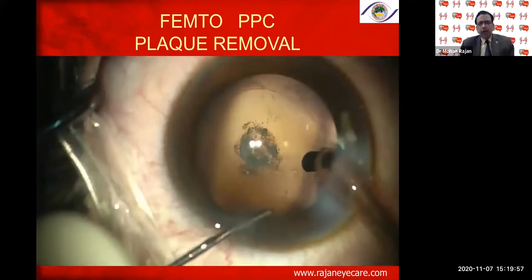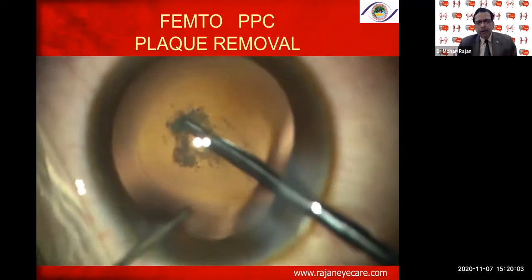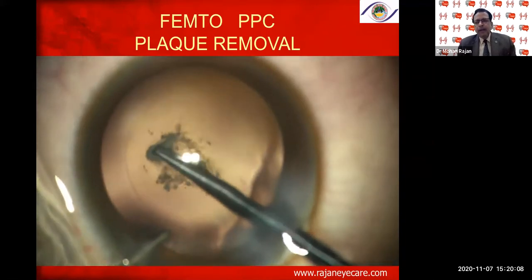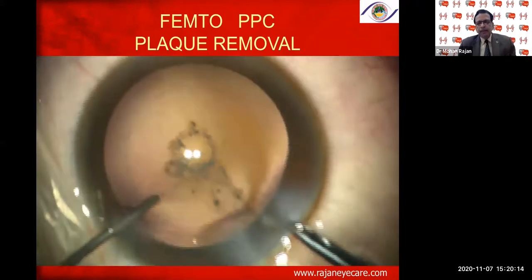You can see there's a dense plaque on the posterior capsule. You can't leave this plaque because you can't YAG these plaques, very difficult. So what I do is I do the plaquectomy. I remove the plaque with a bimanual technique, making sure there's no posterior capsule tear, not damaging the posterior capsule. You can see that bimanual, and you can see that the plaque is also removed.